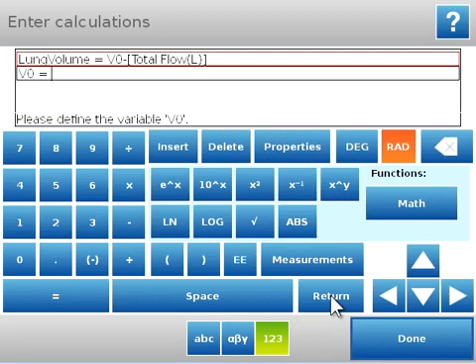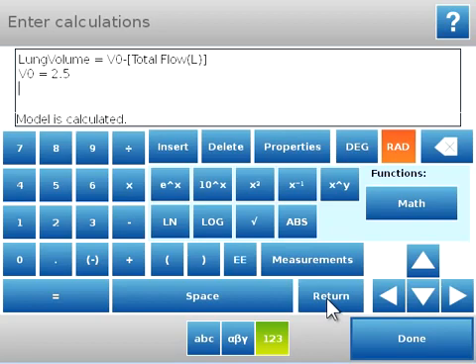This is what's called the functional residual capacity, and for many individuals this will be right around 2.5 liters. So as a person breathes normally, just inhaling and exhaling at a normal rate, there's a large amount of air that their lung has the capacity for, but is not actually being moved during that inhalation and exhalation. So that's the functional residual capacity, the volume of air that remains in the lungs during normal breathing.